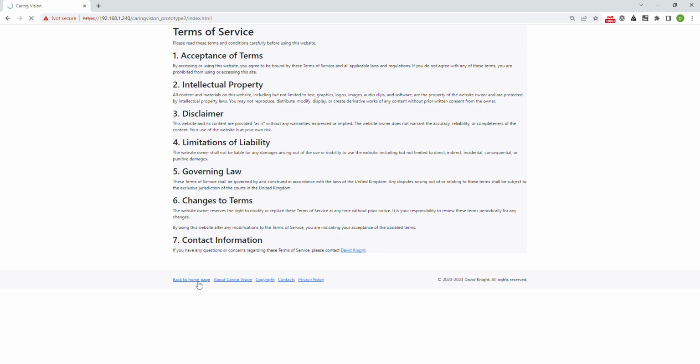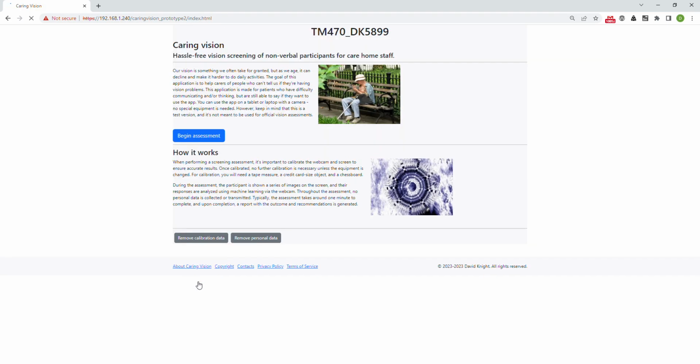So back to the home page then, and you'll see there are 3 buttons on the home page. So you've got the assessment that you can begin if you wish. You've also got 2 other options down here, which are to remove any personal data that's stored, or to remove any calibration data. So the data is stored on the particular system that you're using. Information is taken off the server, but nothing goes back to the server, so no information will be transmitted from the local machine that you're using.